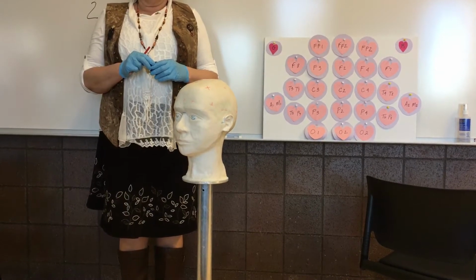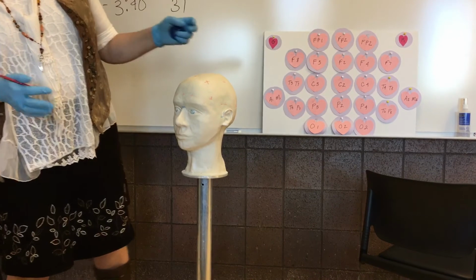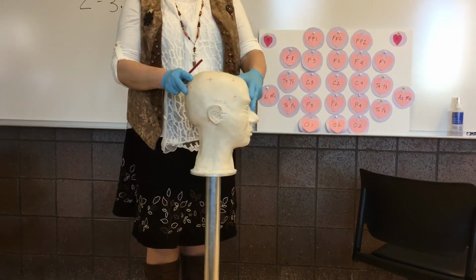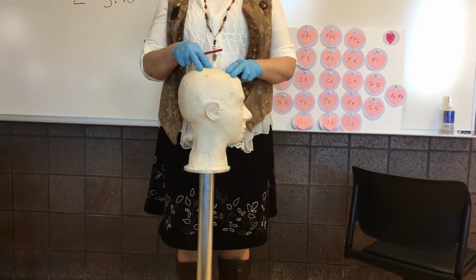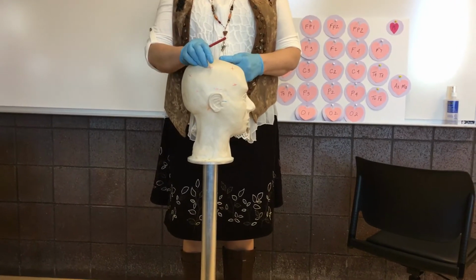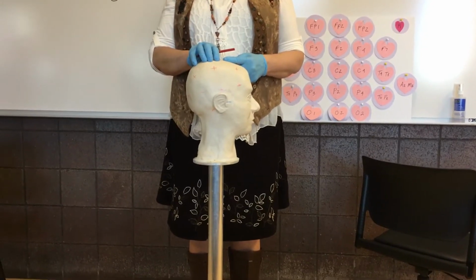If you encounter someone with a deformity or a head irregularity, you need to accommodate that. Someone has a skull fracture, someone has a big hematoma, someone has an intraventricular shunt into their lateral ventricles. It's going to look different on one side to the other, and you adjust your measurements accordingly.